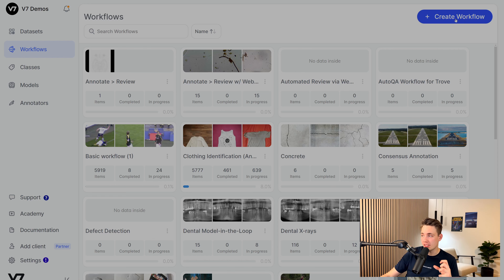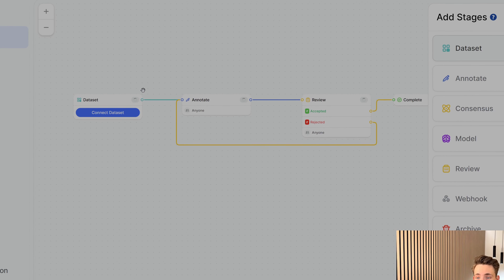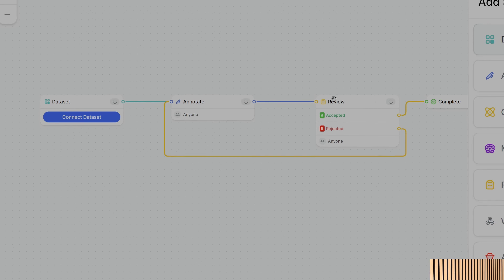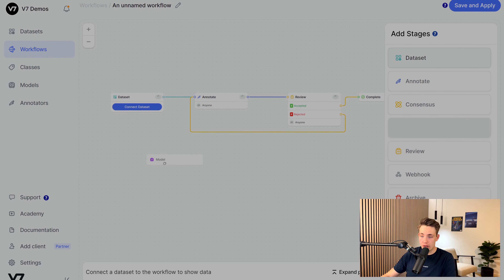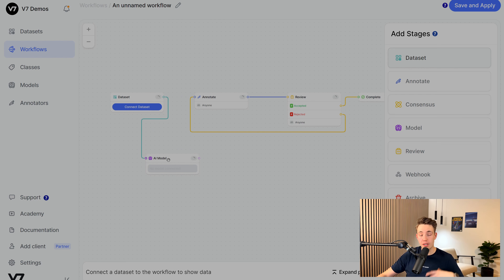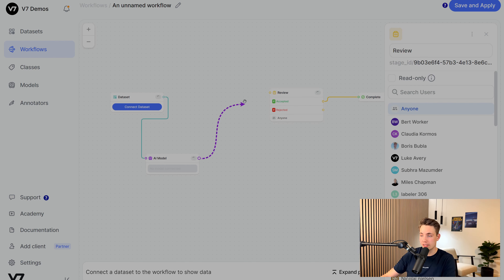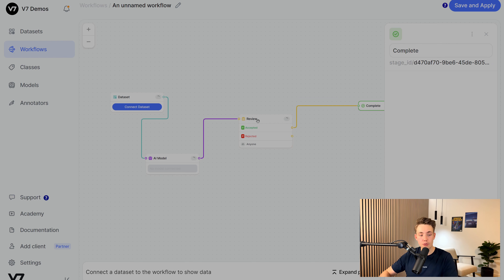Now I'm going to show you how to create a workflow. We hit the 'Create Workflow' button at the top. Here we can see the basic workflow. First we have our dataset, which we connect to an annotation stage. Then we can add different review stages and consensus stages. We can also drag and drop a model in from the right — connecting our dataset to our trained AI model, throwing our WSI files through the model, and then using the trained AI model to auto-label all the cells in our images. After the model makes predictions, we take the output and throw it into a review stage. You can have review stages with standard pathologists accepting or rejecting labels.